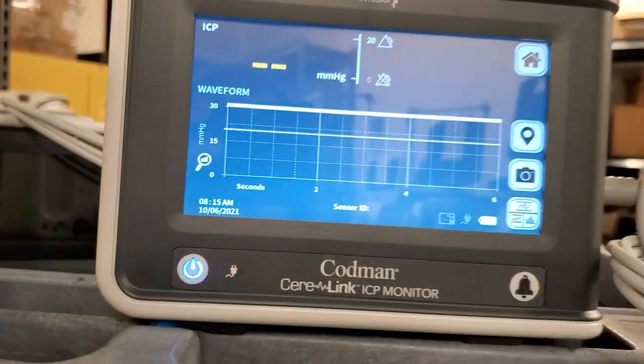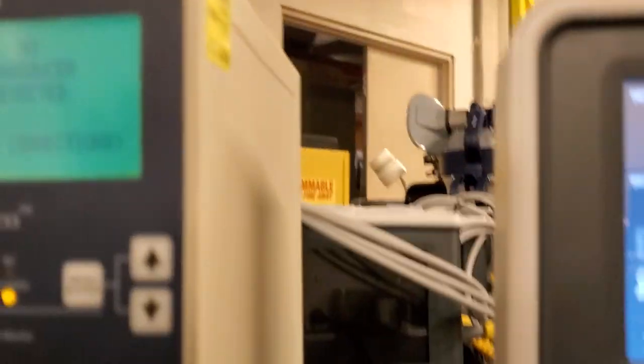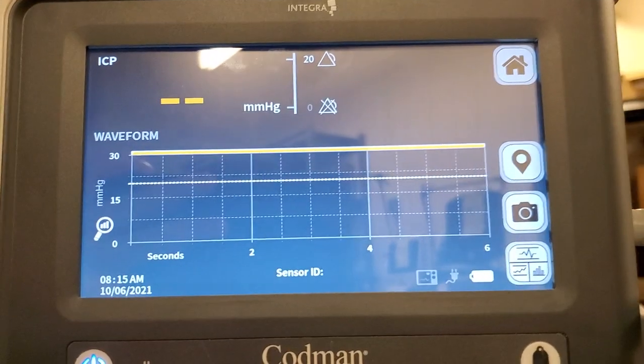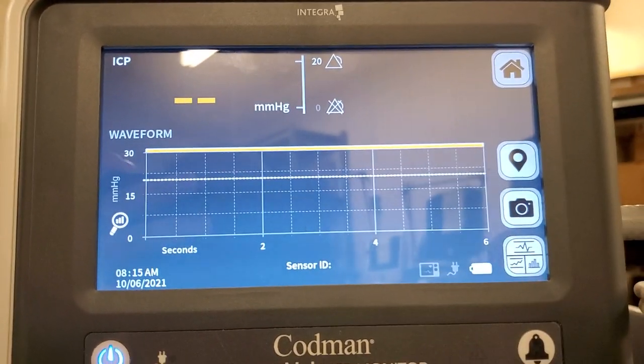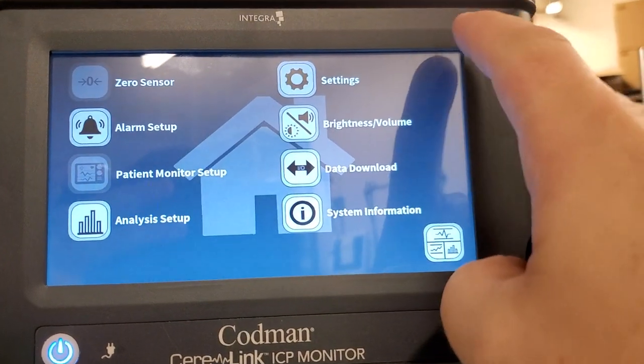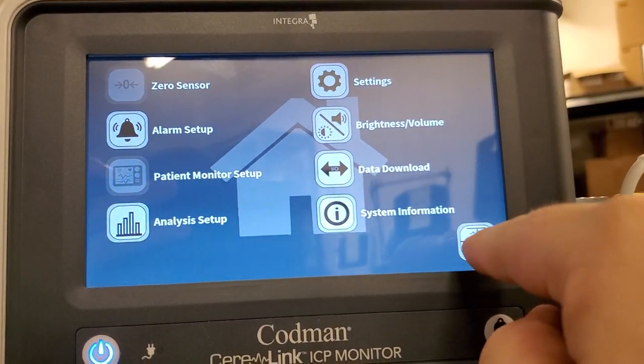A little status indicator for AC mains. So you can see the old display. It's dot matrix style segmented display. And here, look at this high res touch screen. You can take a snapshot. Who only knows what all these other features are? Oh, very good touch screen, too.